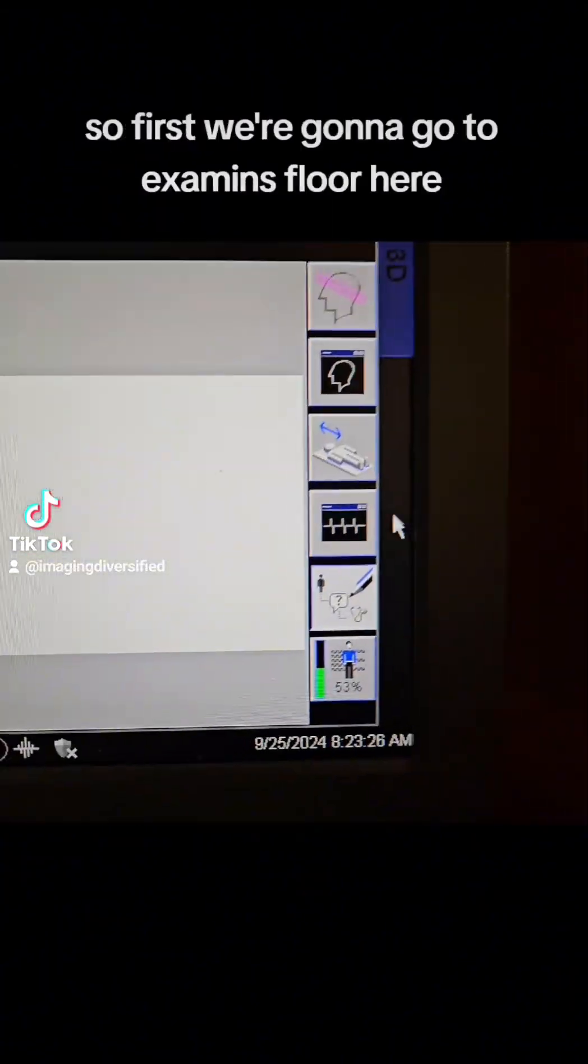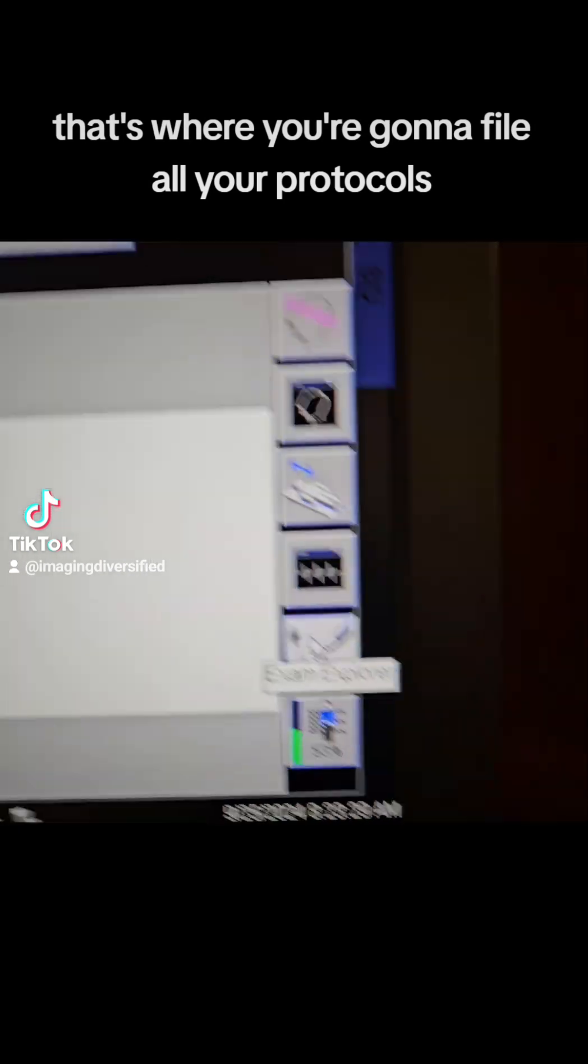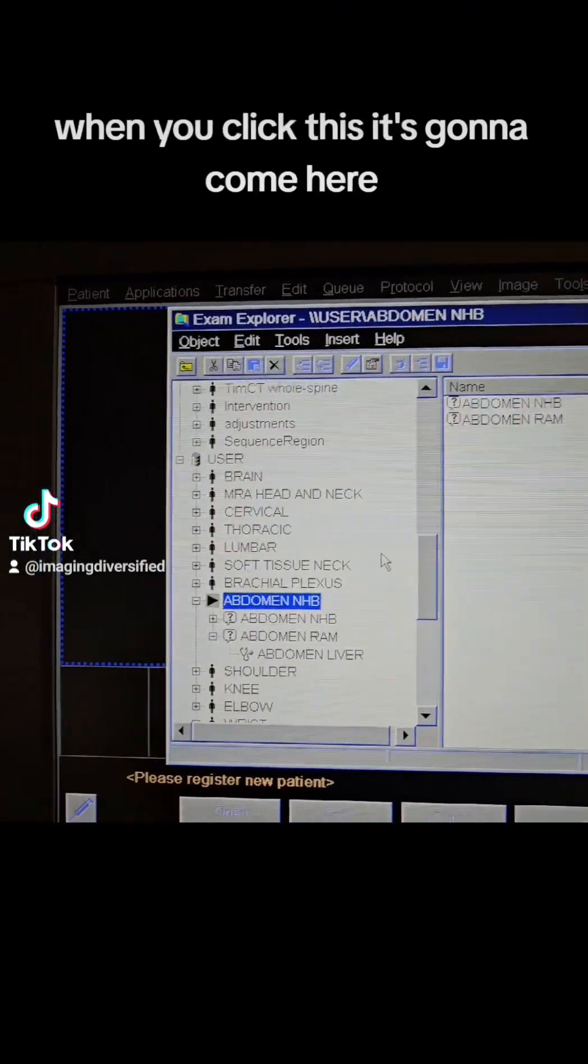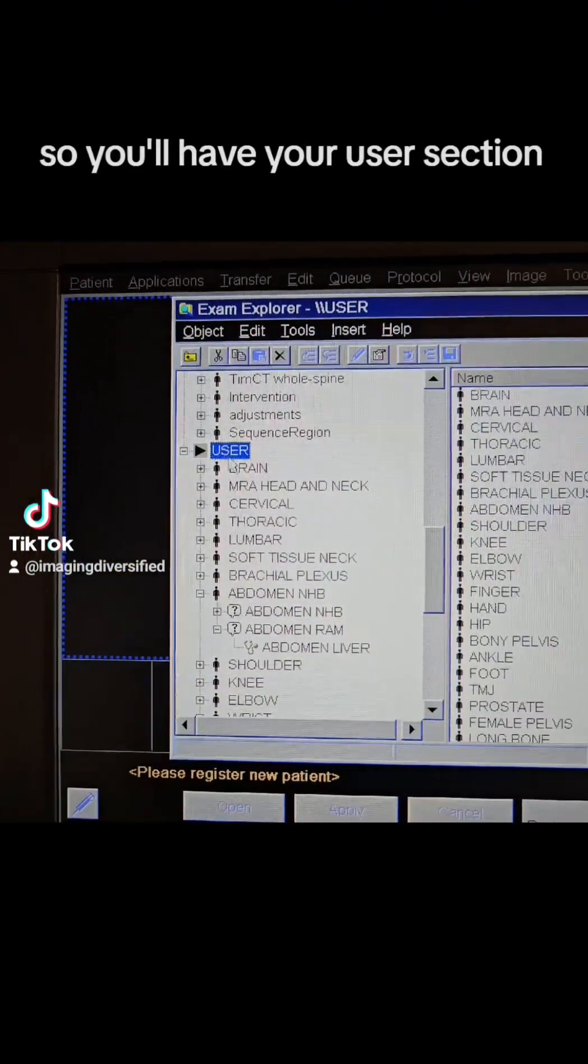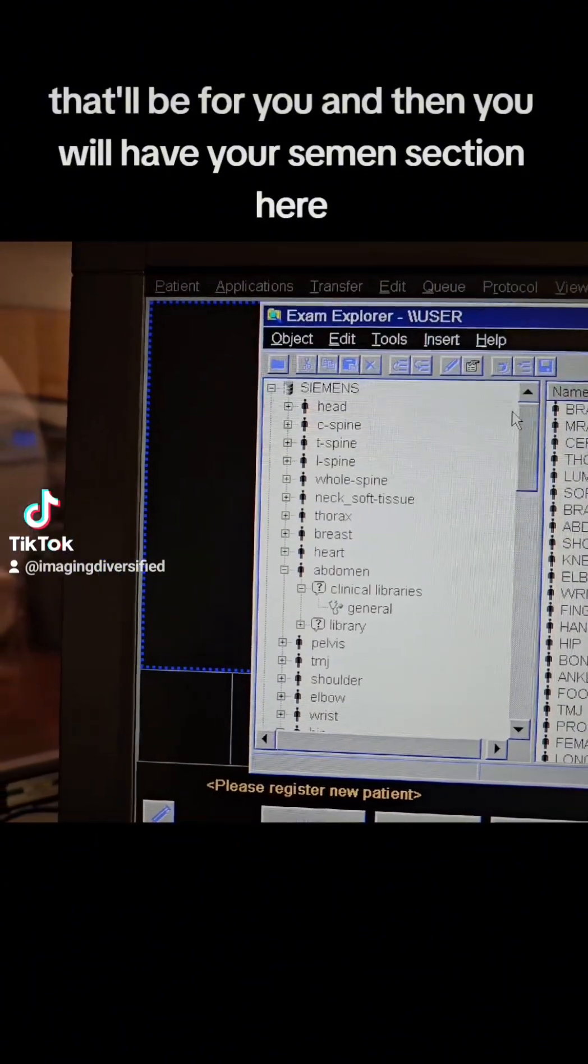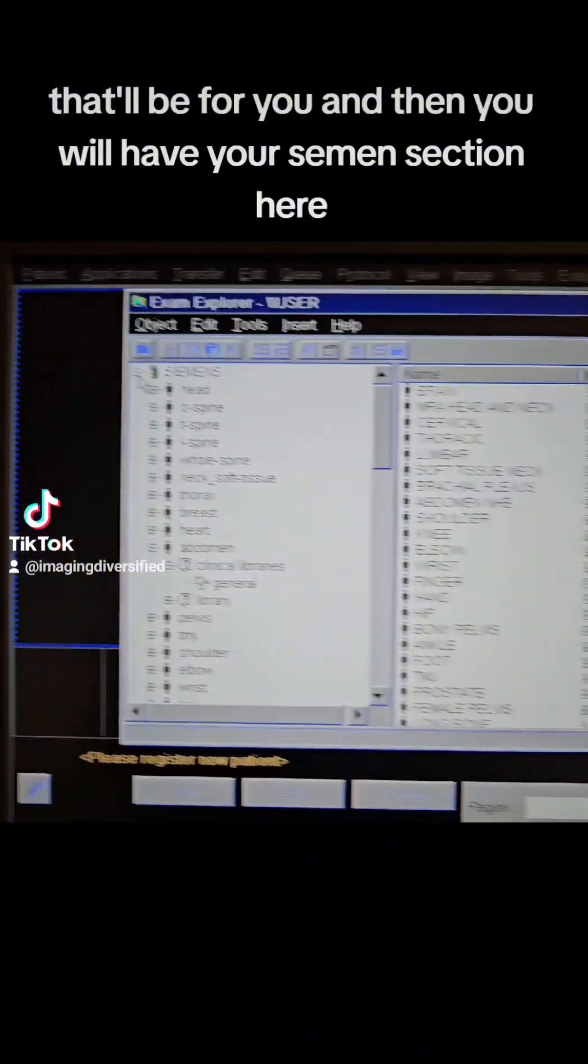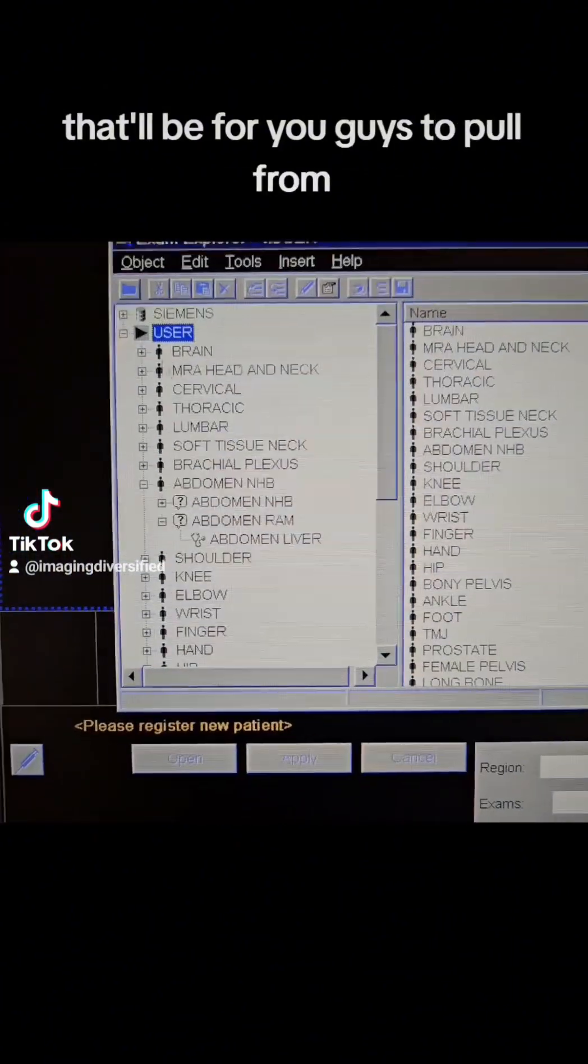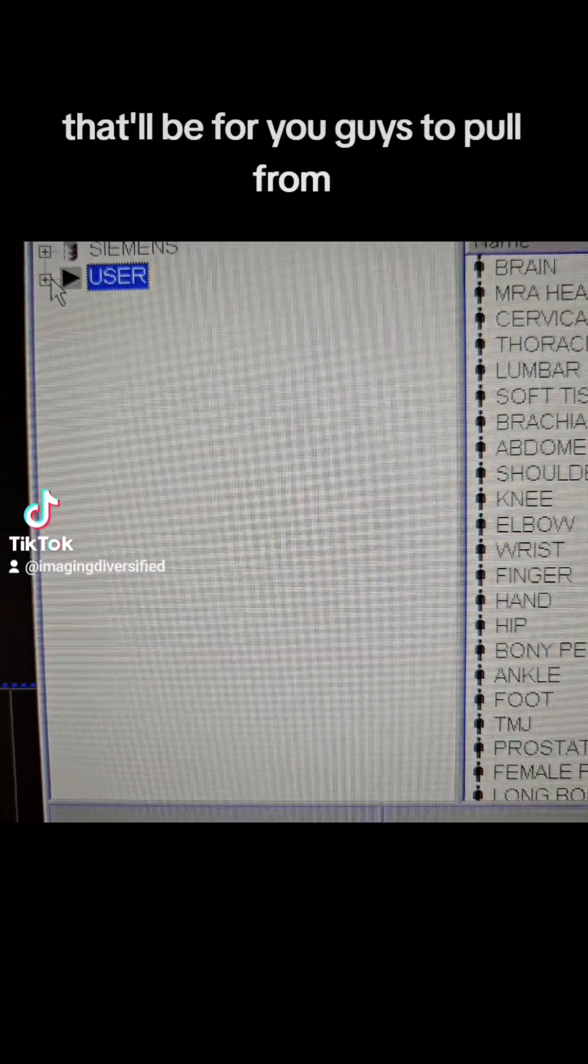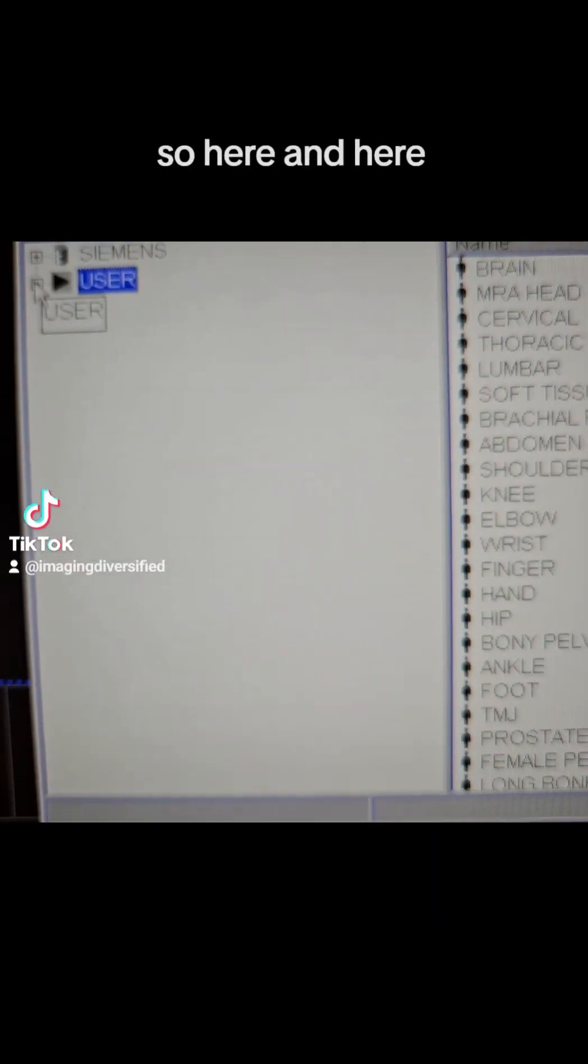So first, we're going to go to Exam Explorer here, that's where you're going to find all your protocols. When you click this, it's going to come here. So you'll have your user section, that'll be for you, and then you will have your Siemens section here, that'll be for you guys to pull from.